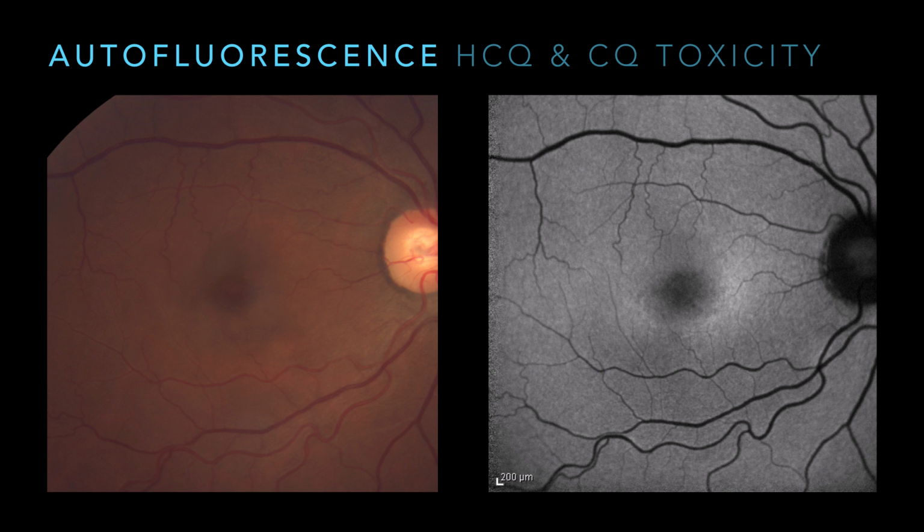So, basically most patients when we're using a Spectralis, they focus with the infrared because it's not very bright on the patient. They don't really notice much. And then when they switch to autofluorescence, since it's a different wavelength, the focal point's a little bit different. So if they don't adjust for that, it'll be out of focus, and then it really may attenuate your signal. The other thing is you have this component of priming. So if I shine a blue light, 488 nanometer wavelength light at the retina for a long time with RPE, it's going to bring out a lot more autofluorescence than if it's really brief or if I have a small pupil.